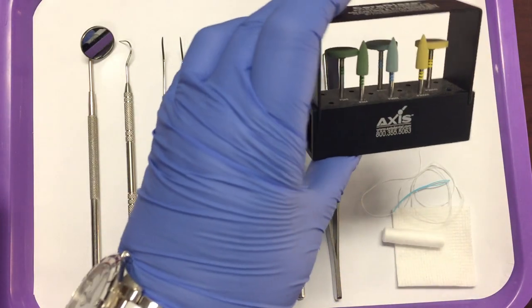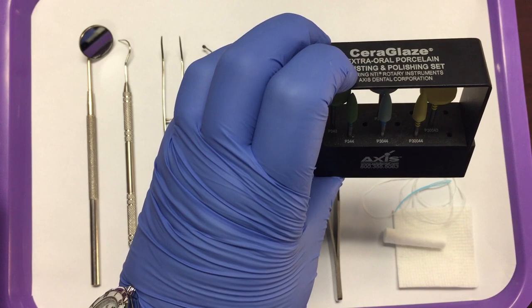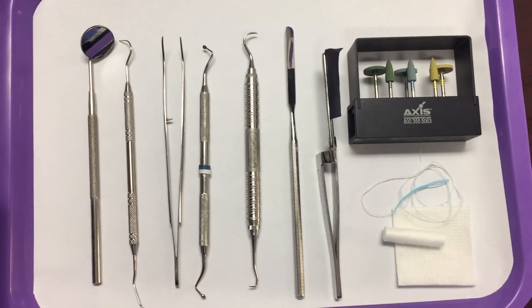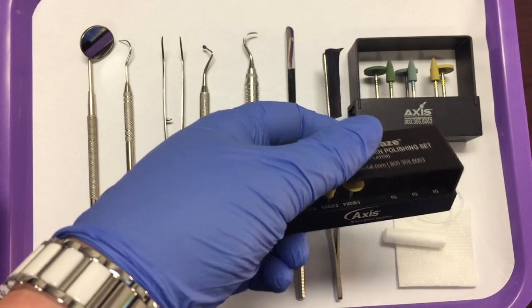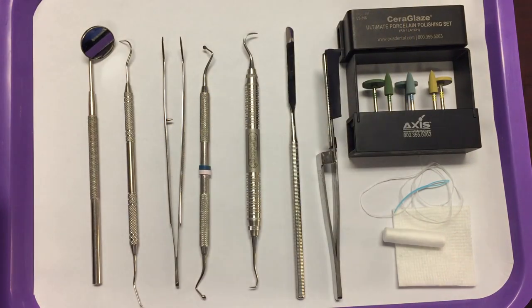The burs that you will need are your finishing burs. These are porcelain extraoral finishing burs. You may also want to include intraoral finishing burs so that once the restoration is permanently cemented in the patient's mouth, the doctor can do final adjustments in the patient's mouth.